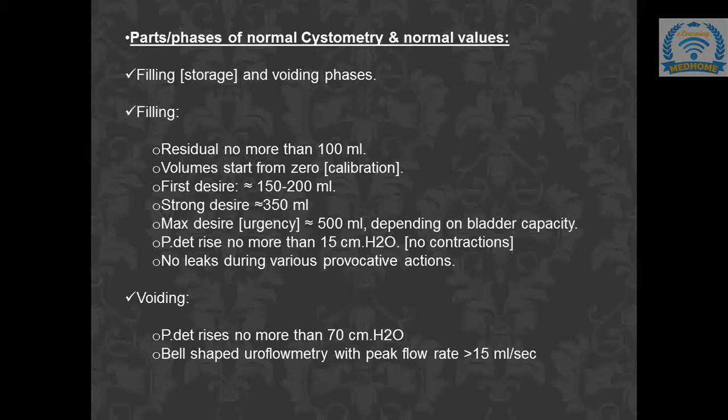Look, if it is stress incontinence, the pressure of the detrusor muscle will not rise. It will be no more than 15 centimeters, that means less than 15 centimeters of water in the filling phase.